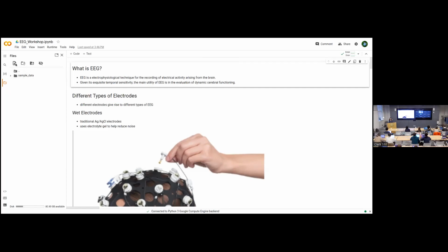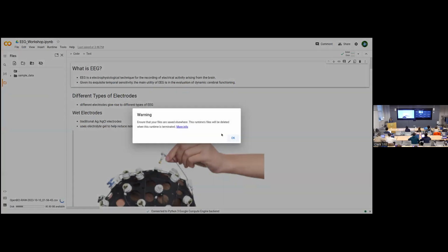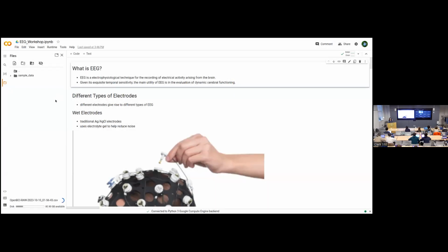When you click on it, you can select upload data. You can go into your downloads, and then select the data that we provided for you in the email. It's only sharing this Chrome tab, that's why it's not showing the pop-up window. But when you're uploading the data, it should prompt you to select the data that you downloaded. Is that working for everyone?